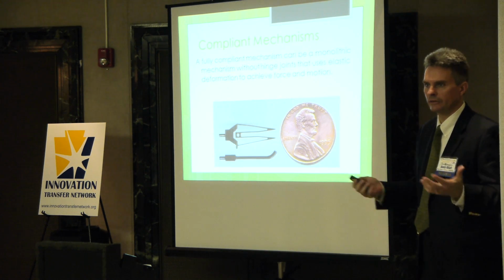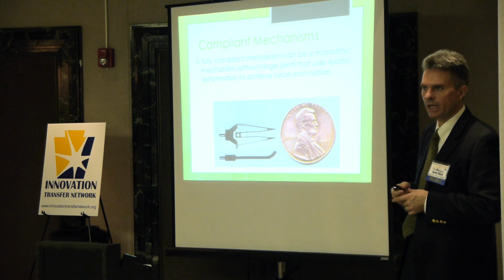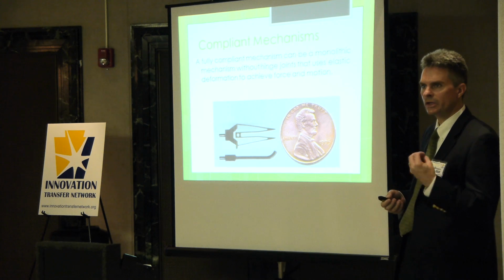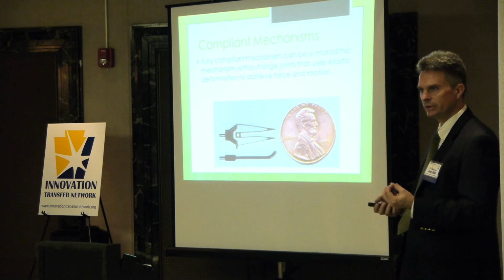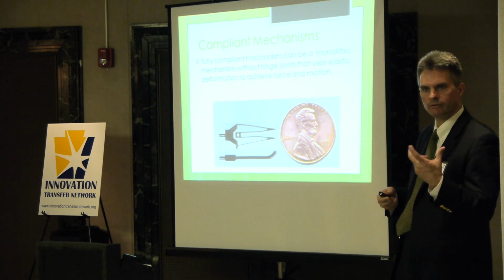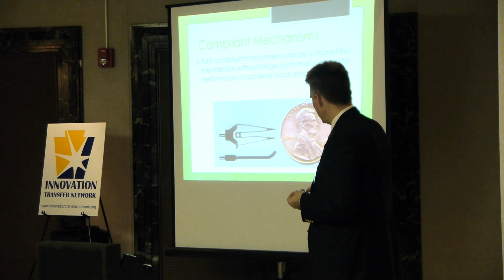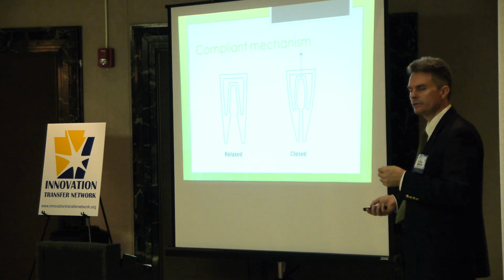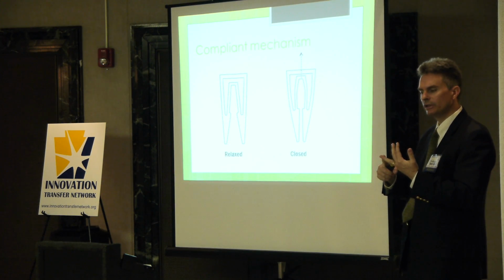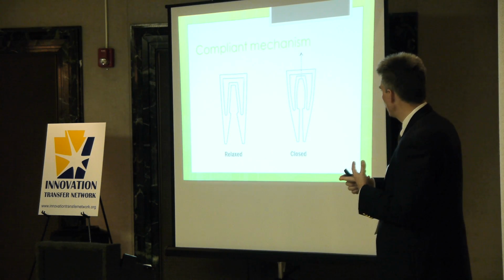So here's some of the things we've done over the years, what I've been asked to talk about. This work was in conjunction with Dr. Mary Frecker, primarily at Penn State main campus in mechanical engineering. And we've done work on compliant mechanisms, basically solid semi-elastic materials, hingeless materials that when you push on them in one way, they deflect and deform and create force to enact a task. And as you may think, without hinges, without multiple components, there's an ease of manufacturing issue, there's a scalable issue or benefit. There's a multifunctionality benefit, which we'll talk about.